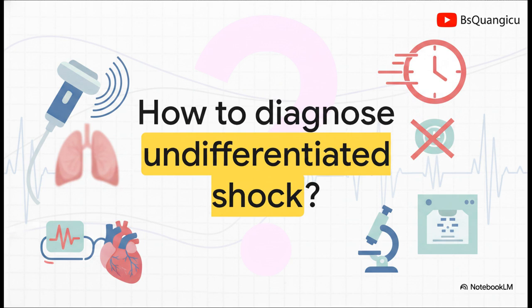I mean, when a patient is tanking, sending off conventional labs, or waiting around for a CT scan, yeah, that's just way too slow. You don't have the luxury of time to guess if you're dealing with cardiogenic, hypovolemic, obstructive, or distributive shock. Every single second matters here.